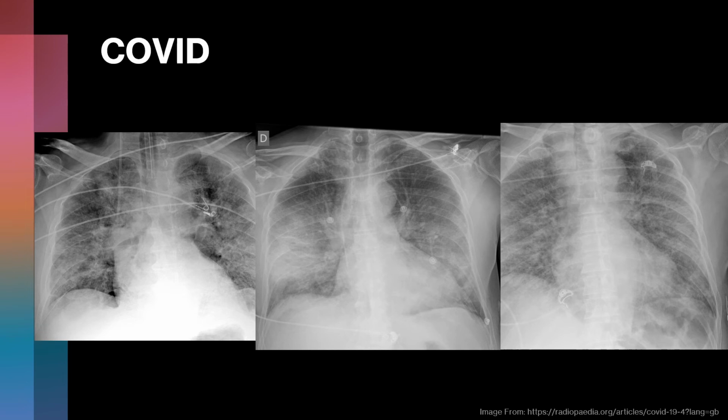And when looking at corona on CT, you can often see a ground glass appearance or opacities with airspace consolidation, crazy paving appearance, bronchovascular thickening, and traction bronchiectasis.